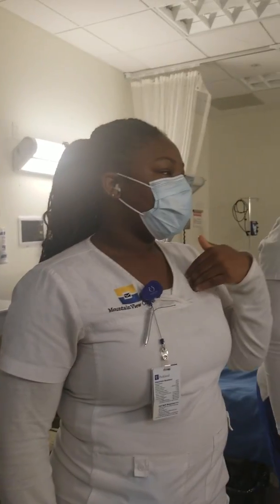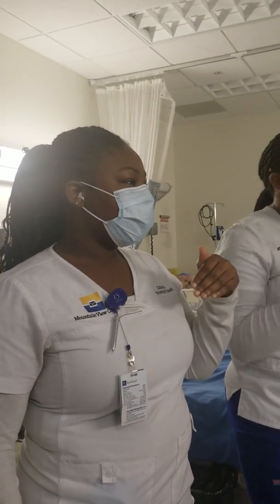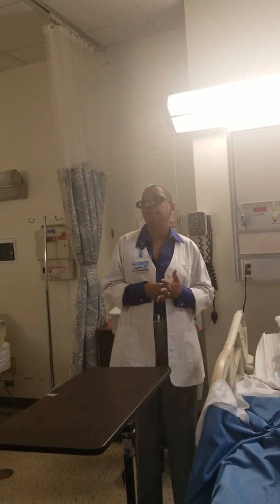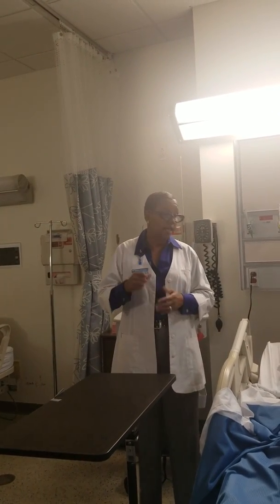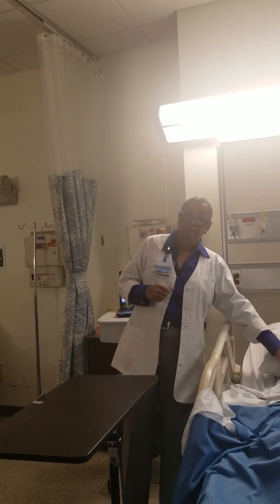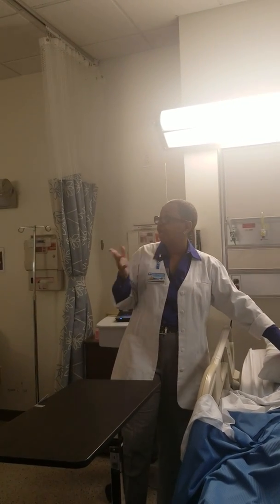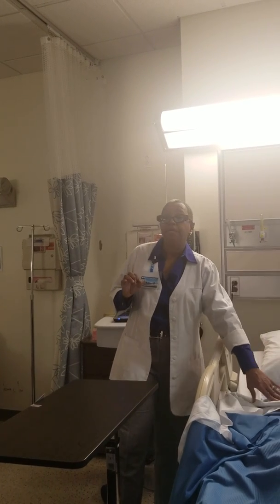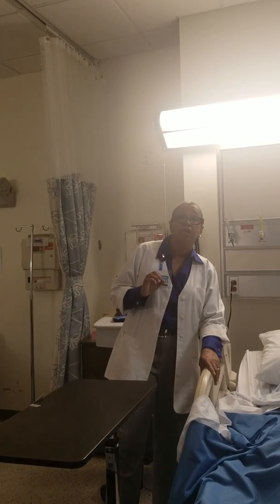And we don't insert the catheters ourselves. The doctors do that, right? No. But PICC lines, a lot of nurses are PICC certified, and they are inserting those lines. They'll use a sonograph and things. But central lines, those are healthcare providers. Most of your physicians are inserting those. PICC lines, your nurses can insert those.